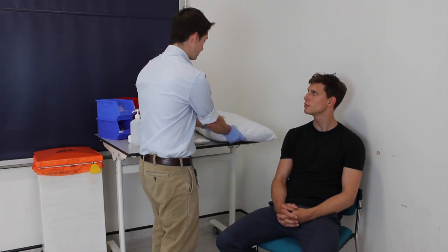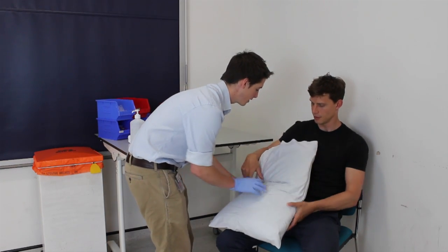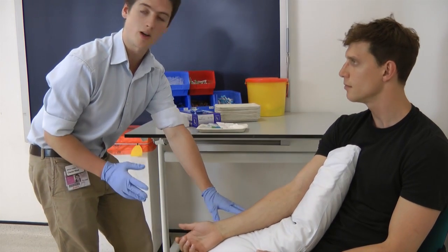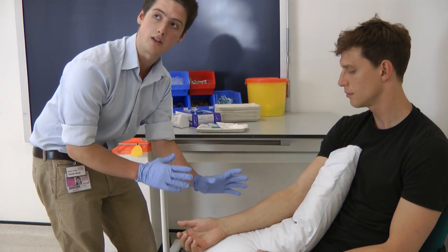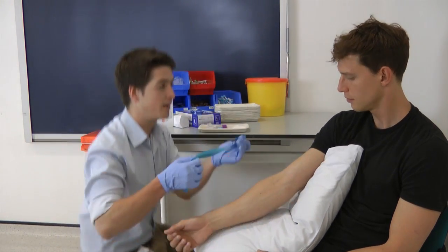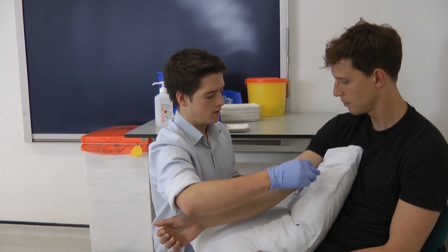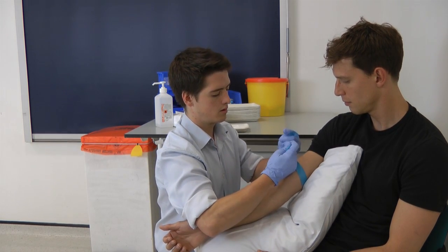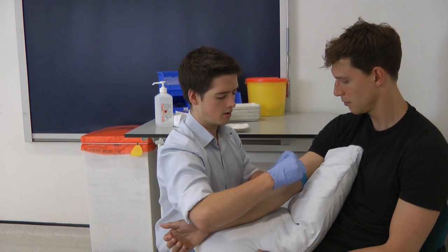So if you're ready, Mr. Searle, I'll just give you this cushion — it'll be a little bit more comfortable for you to rest your arm on. That's great. Is this arm okay to take blood from? That's fine, yeah. So as well as making the patient more comfortable, the cushion will also help keep the arm nice and still and let you get a good angle at which to take blood from. And I'm just going to attach this band tourniquet around your arm now. That's okay? Sure. It might be a little uncomfortable.